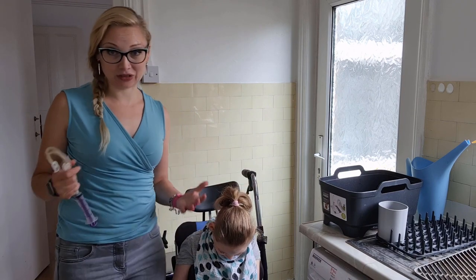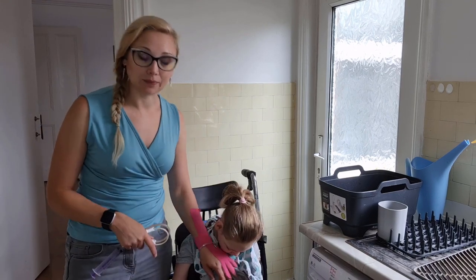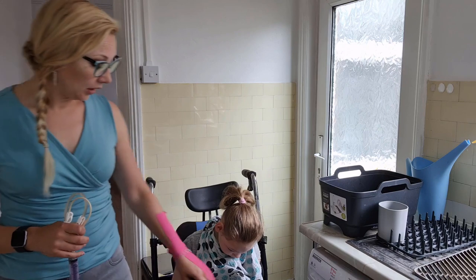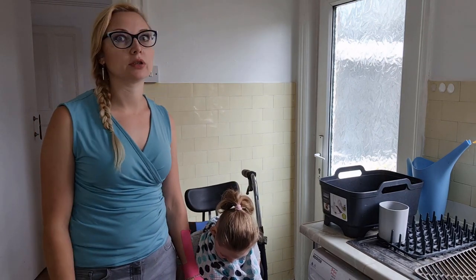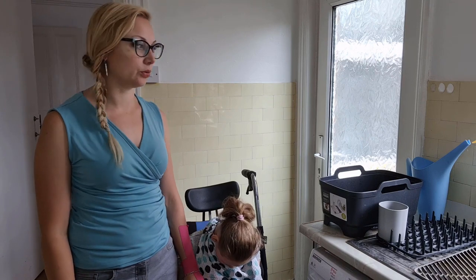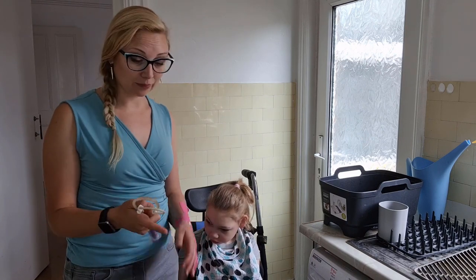Eileen has a feeding tube. She doesn't eat orally and she has what's called a mickey button, which you can't see at the moment, but I will pop in a photo. I will show you her mickey button in a minute when I move the camera.